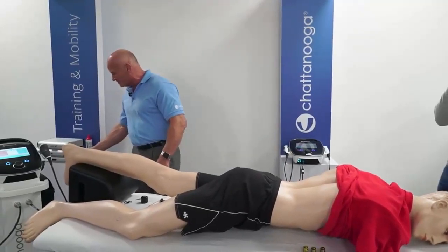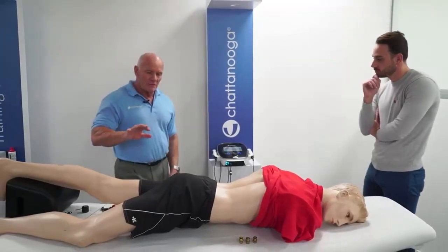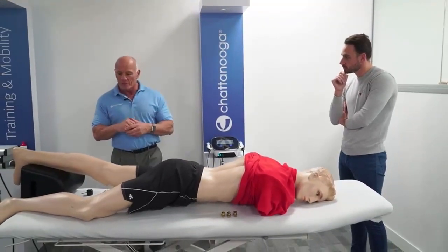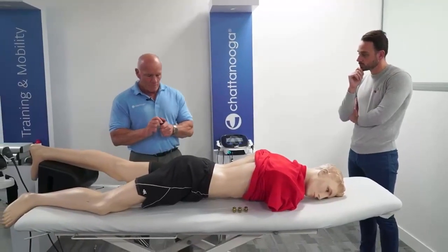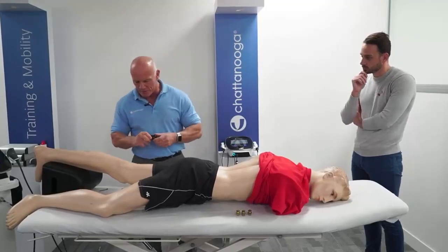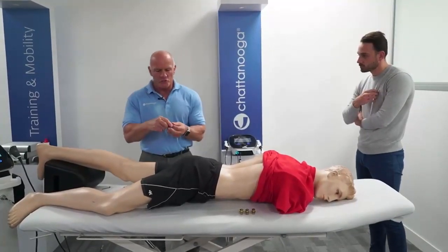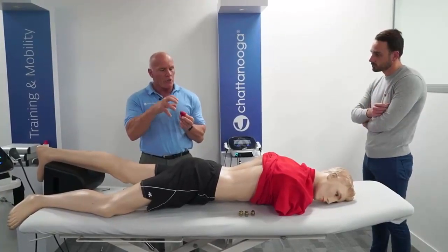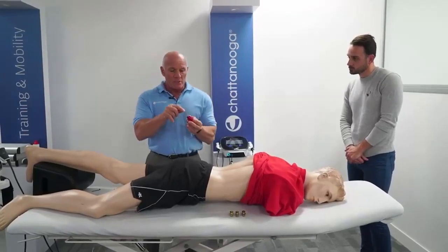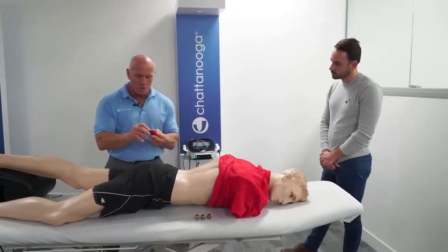And how often do you clean the transmitters? So the transmitter, you don't need cleaning. Okay, I'm going to correct myself there, because when I say cleaning, ensure you use an ultrasound, a water-based gel medium. Remember, shock waves and radial pressure waves travel really well through water. So they can build up in there.